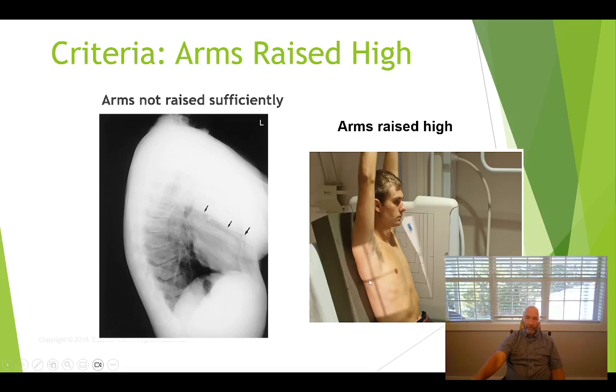This was performed with the patient in the bed. You can see this thing behind the patient, and then you've got the bed behind that thing. So this is good positioning for that. What you need to keep in mind is most of your patients who can't get out of bed, especially, and we're doing a lateral chest X-ray on her, they're sick. That's why you can't get them out of bed. And what happens in a lot of cases is, try to put yourself into this situation where your legs are out straight and somebody sits you up at a 90-degree angle.